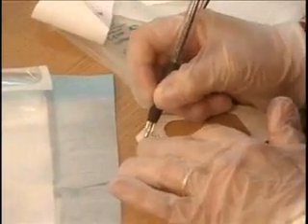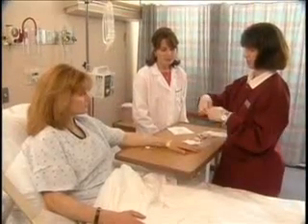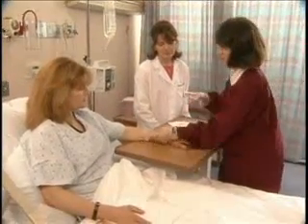Date, time, and initials. Now I'll tape the extension tubing to keep it in place and prevent dislodgement.